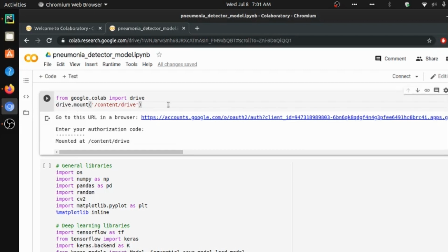So instead of using our own hardware in order to train the model, we have used Google Colab so that we can access high-end hardware, that is GPU and high RAM, without any limitations. So first, what we have done, we have saved our images in the drive. They are saved in a folder that is chest_X-ray, and then we are importing our drive in our Colab file.